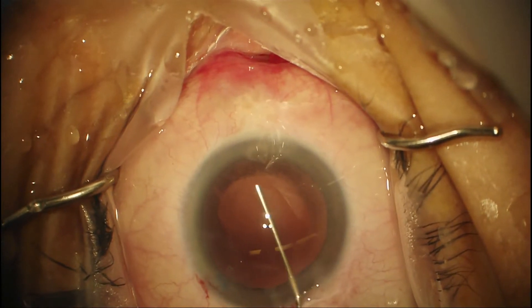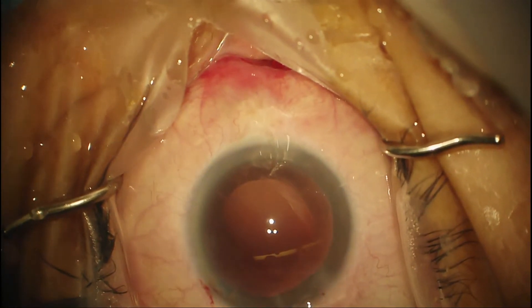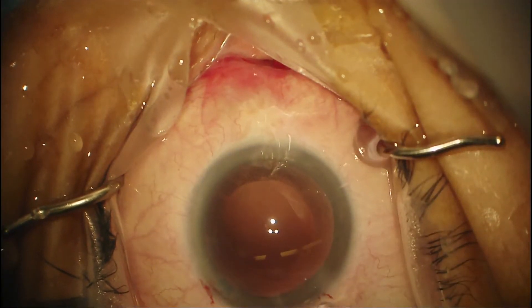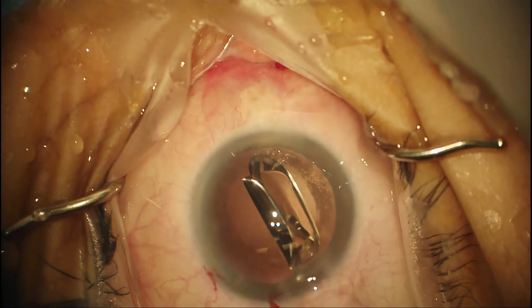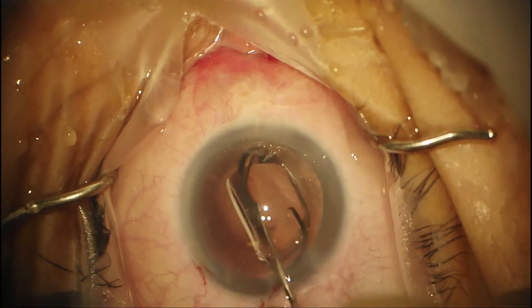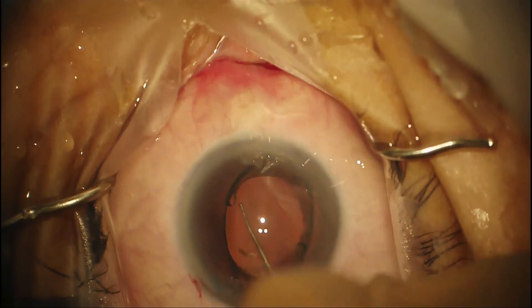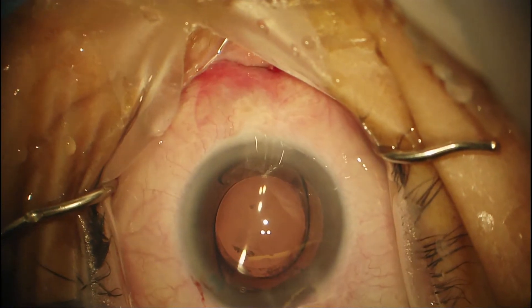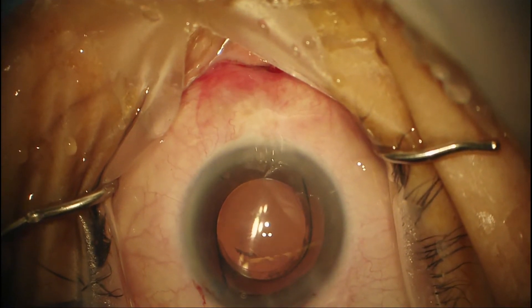Everything is going smoothly. We're going to fill the anterior chamber with viscoelastic — this will be ProVisc. You want to put a big firm fill of the eye; especially when you're starting, you'd rather have too much than too little. This is the Monarch injector and we're going to be injecting the SA-60AT lens with the Wound Assist. Rotate the screw on the injector and the lens comes in nicely and gently without aggressive haptic unfolding. I use a Sinski hook to put it in the capsular bag, and if the haptics are stuck to the optic, you just free them up by nudging them where they want to go.